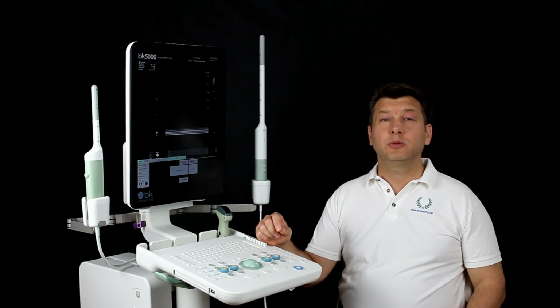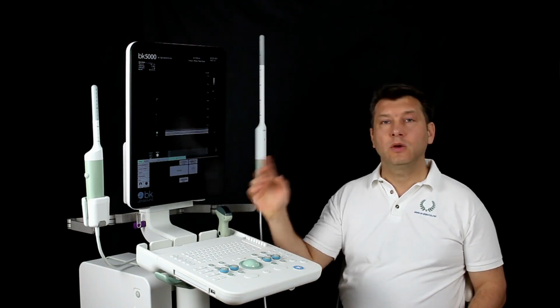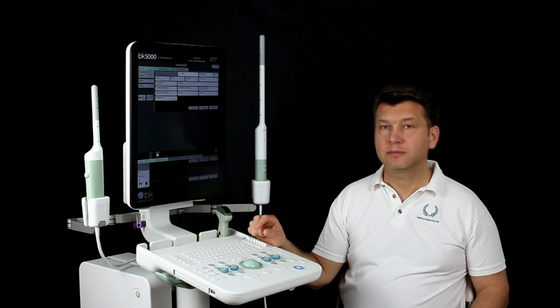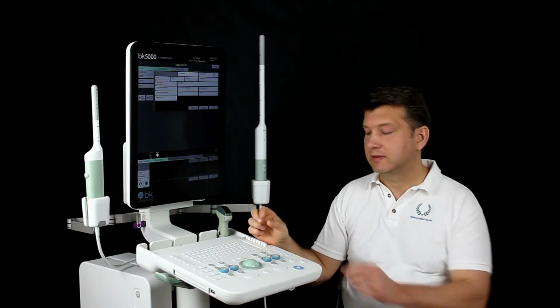In this video I show you how to perform a transperineal examination of the pelvic floor with the BK 3000 and 5000. We start with the entry of the patient ID. We press this button. Then we fill in these values and press Next.